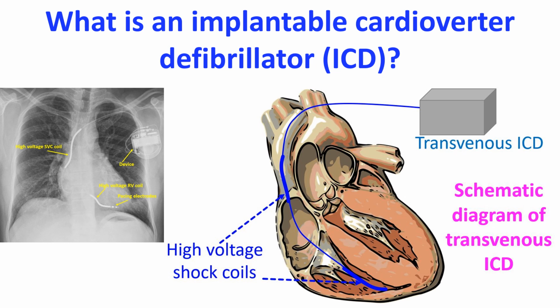Implantable cardioverter defibrillator, or ICD, is a cardiac implantable electronic device, or CIED. The device is implanted subcutaneously under local anesthesia, usually below the left clavicle. The electrodes from the device are introduced into the right-sided cardiac chambers through a subclavian vein puncture.